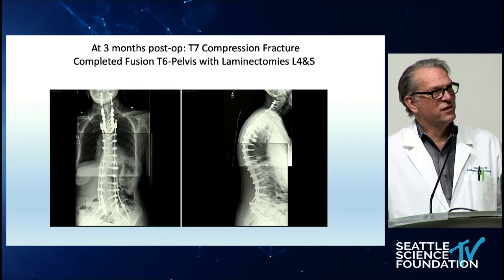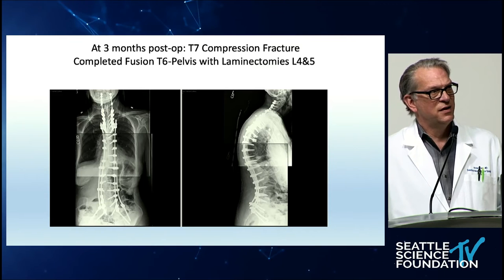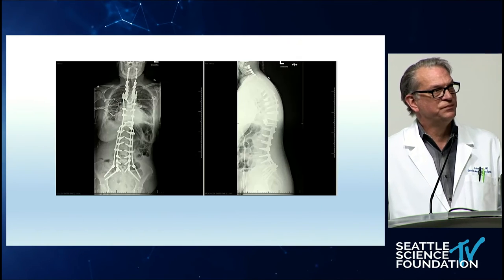And so this is an example of dominoing on. Those are dual dominoes. I never use only one domino. I might like to extend those even further up into the lower thoracic instrumentation today, and again, quad rod construct below protecting the lumbar fusion.